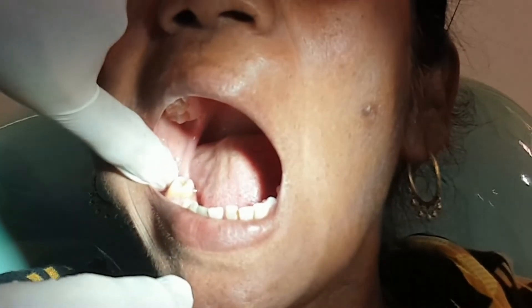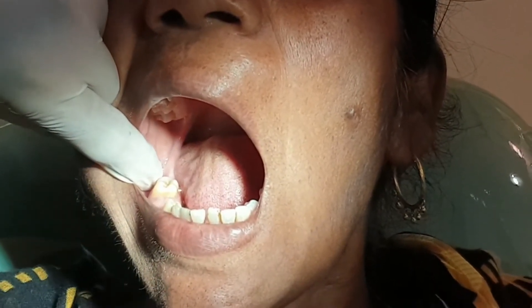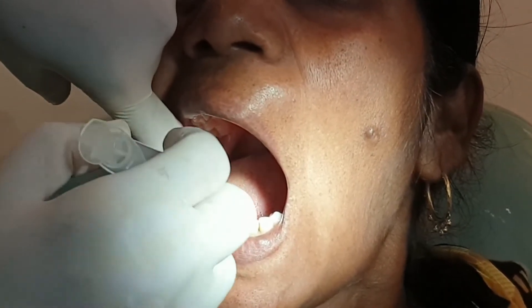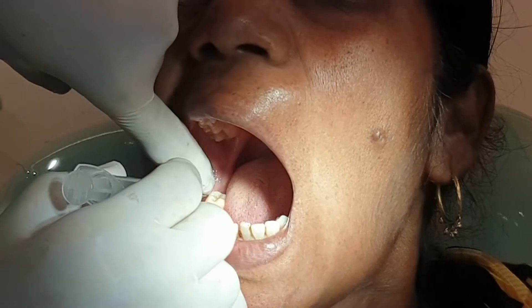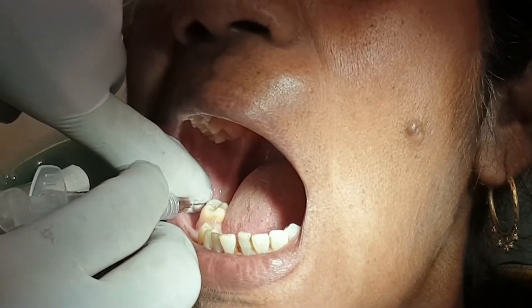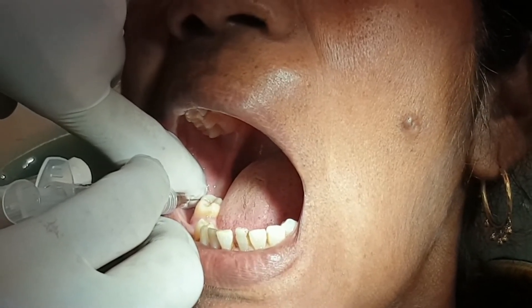This is the point of insertion of the needle. A 1.5x8 needle is inserted distal to the molar. 0.5 ml of the local anesthetic solution is deposited after negative aspiration.